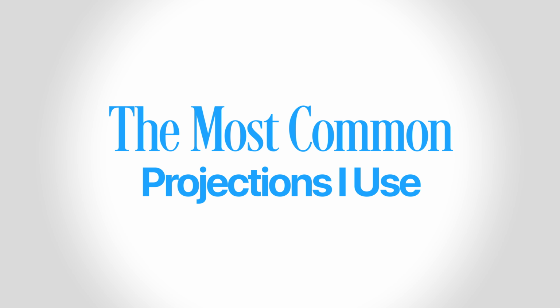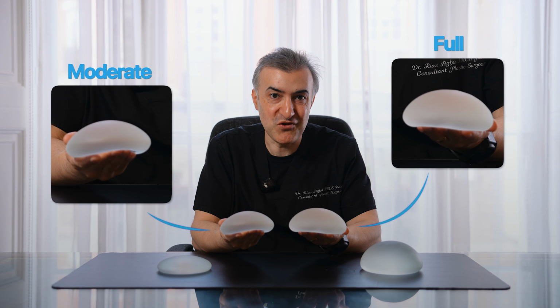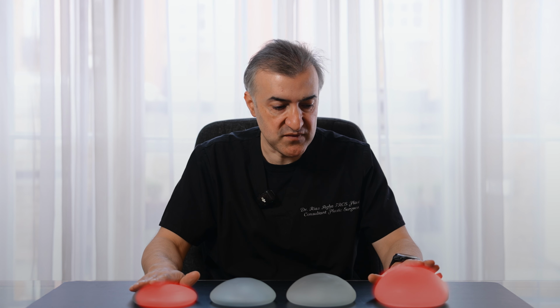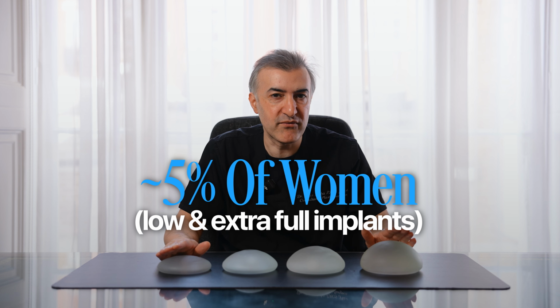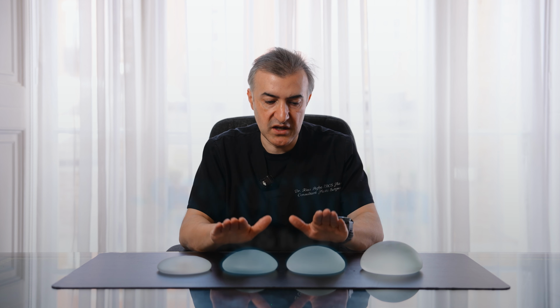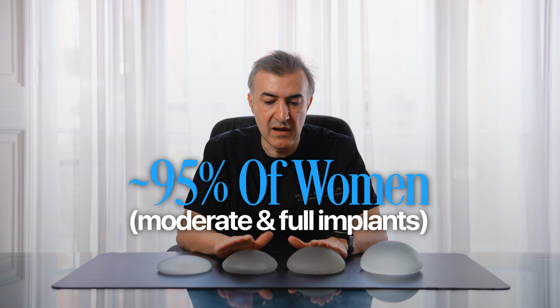So just to wrap up, the most common projections that I utilize for my patients are moderate, followed by full. These are the ones that I have the most of in the clinic where people can try them on, because typically we don't as often go to the more extremes of size, but I do have them, we do use them, and they're probably applying to less than 10% of women, but probably around 5% of patients would be going towards these categories of projections. The 95% would be really in the sweet spot of moderate and full, with the majority of those probably being the moderate projection that we use.